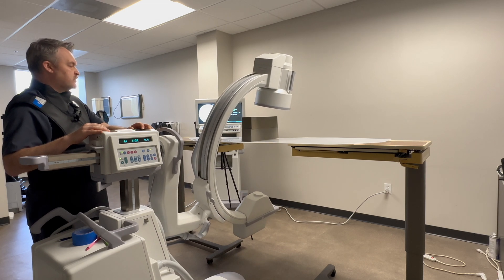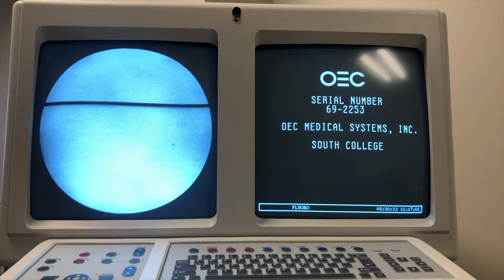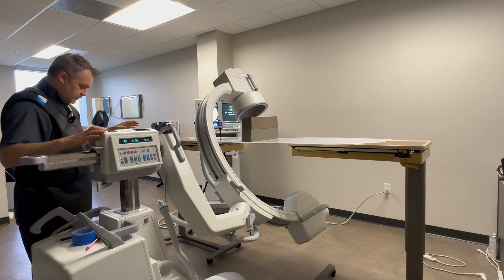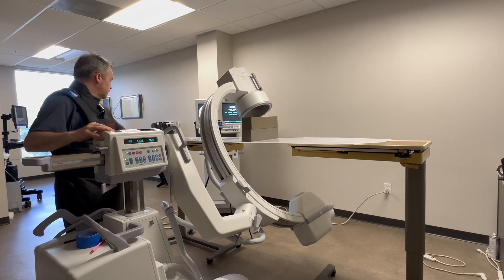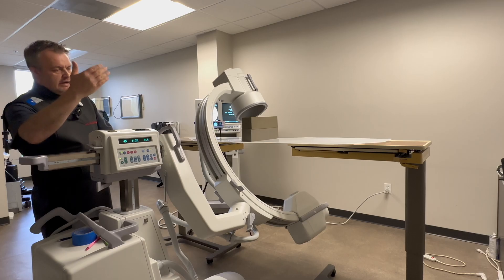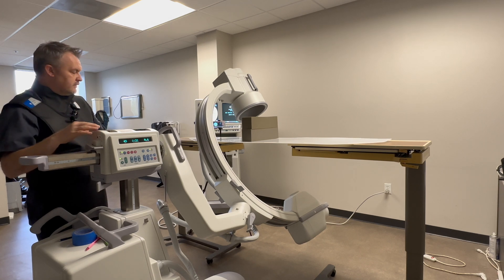When the machine travels to the outlet, again you can see that the wire is now travelling up the screen. So in order to keep that anatomy centred, the technologist would have to slide the machine north and take an image, slide north again, then come back, tilt, and slide the machine south to compensate for the inlet.